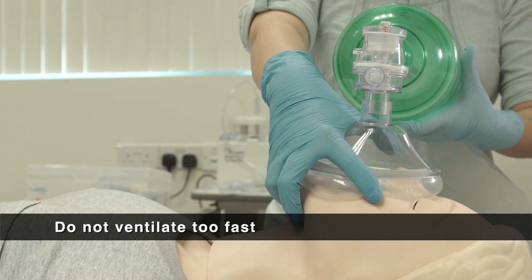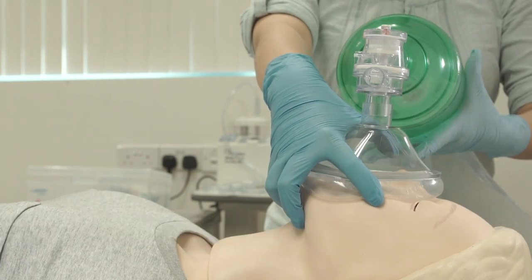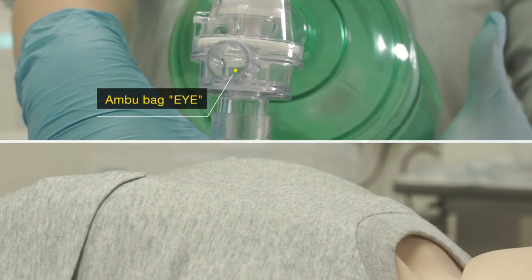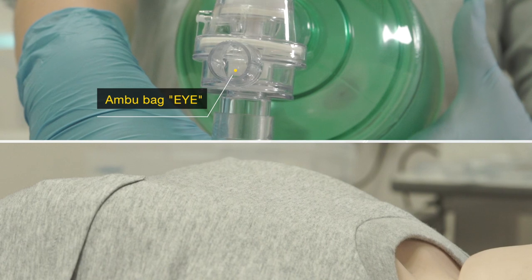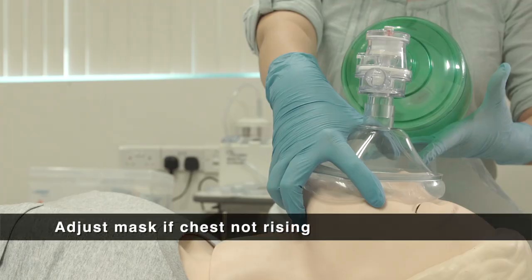Do not ventilate too fast, as the patient will not have enough time to breathe out completely. If the patient can breathe, follow the patient's breathing pattern to squeeze the Ambu Bag. Look out for the valve on the Ambu Bag and the patient's chest rise. Adjust the mask and the position of the patient's head if the chest is not rising.